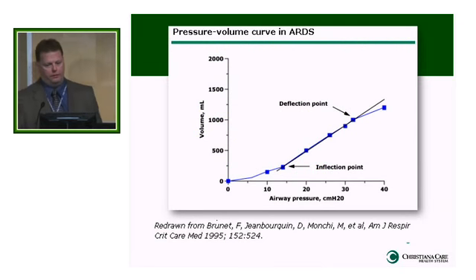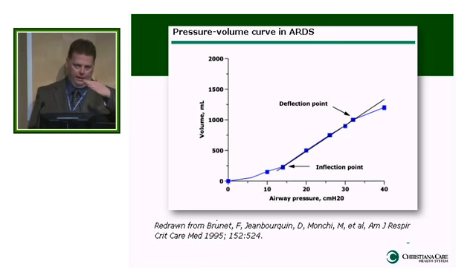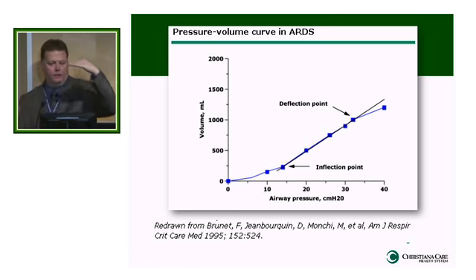Well, this is a very simplified version of a super syringe method where as you add volume and pressure, you map it out. You have the curve here, and you heard other lectures, I think Dr. Bashi talked about this, ventilating at the sweet spot or where they're most compliant. The most compliant part of the curve is where it's pointing upward farthest. And where you're least compliant is where it's laying over. So the top lays over and the bottom lays over. Those are very non-compliant areas.